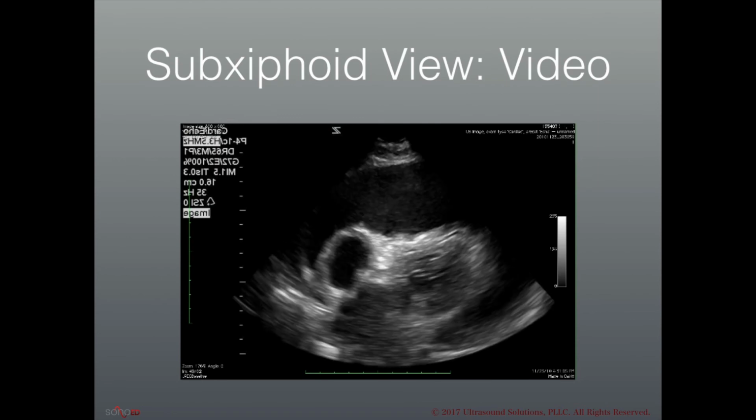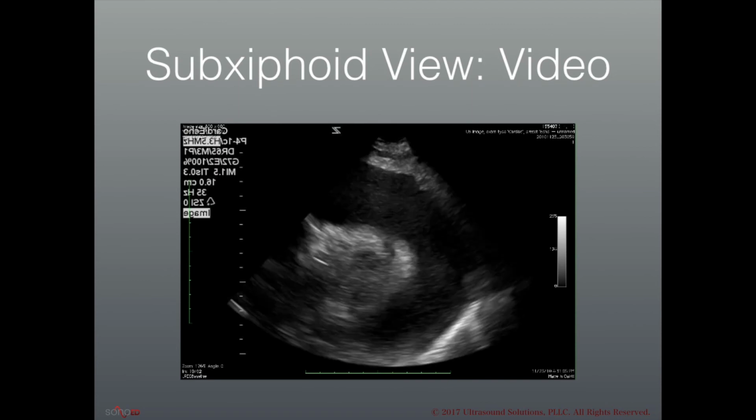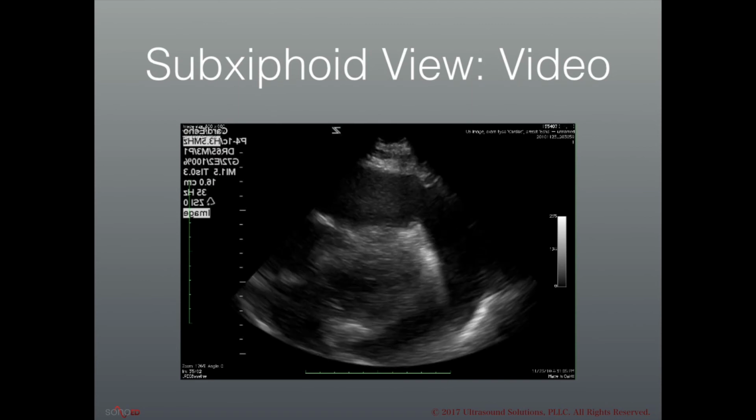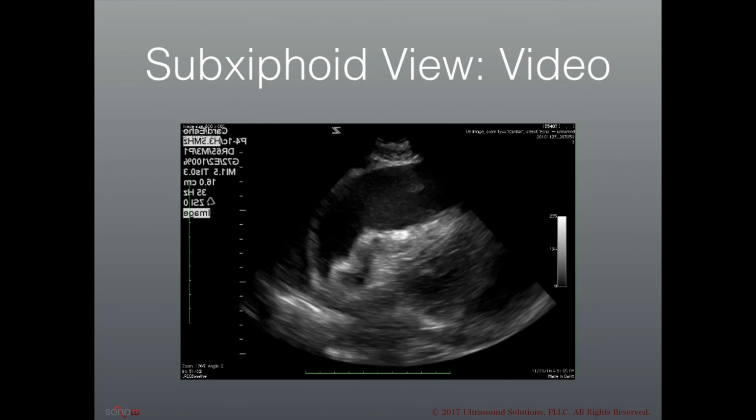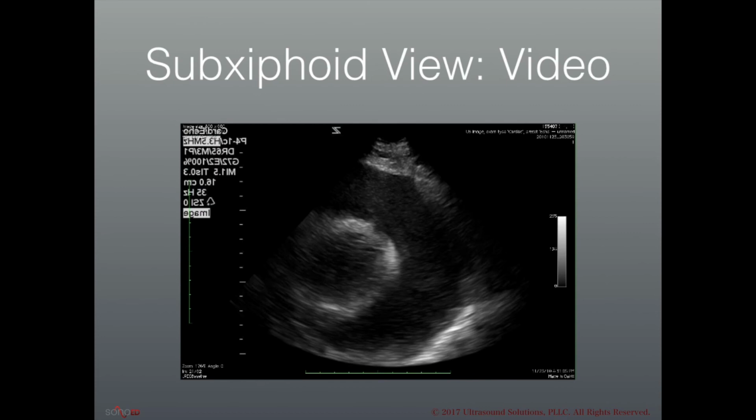There are more advanced techniques to assess for cardiac tamponade, particularly in the early phases. However, in general, I just look at the right ventricle and right atria, and I ask myself if they are functioning in correspondence with the left side of the heart or if they appear collapsed in diastole.